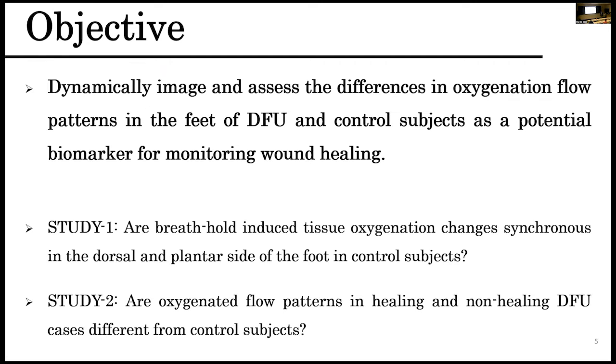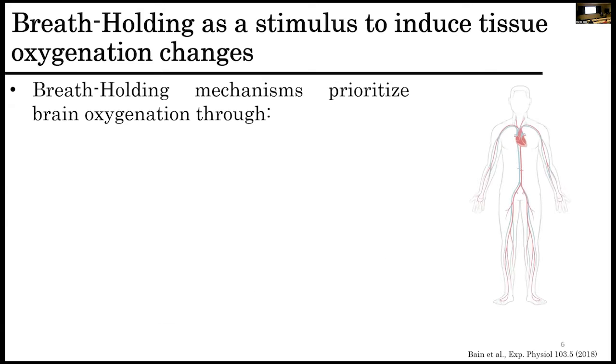So the objective of this work is to dynamically image and assess the differences in oxygenated flow patterns in the feet of DFU and control subjects as a potential biomarker for monitoring wound healing. This work was broken down into 2 sub-studies. In study 1, we'll be looking into whether breath hold-induced oxygenation changes are synchronous in the dorsal and plantar side of the foot in controls. And in study 2, we're going to assess if the oxygenated flow patterns in healing and non-healing DFU cases differ from controls.